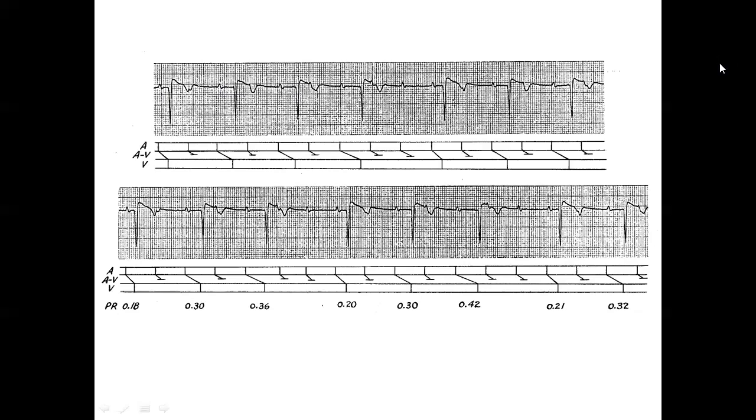Interesting situation. What do you call that then? Well, second-degree AV block, type 1, of course. That is a block within the AV junction due to reversible conditions. Most likely, this patient will not end up getting a pacemaker.